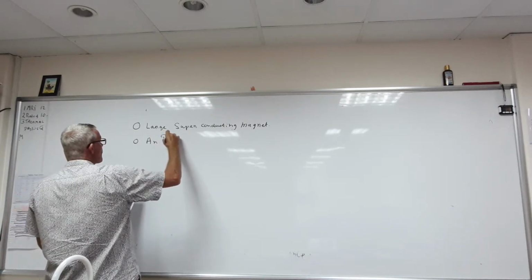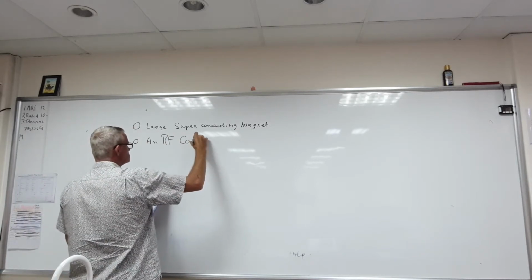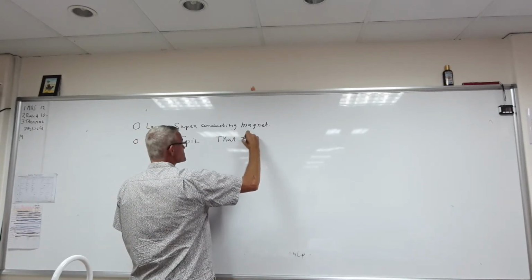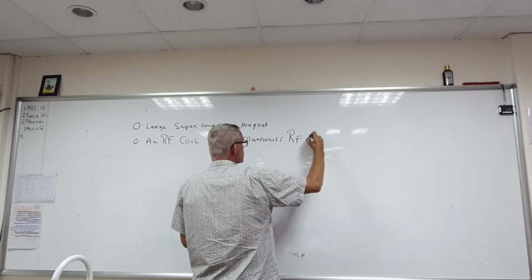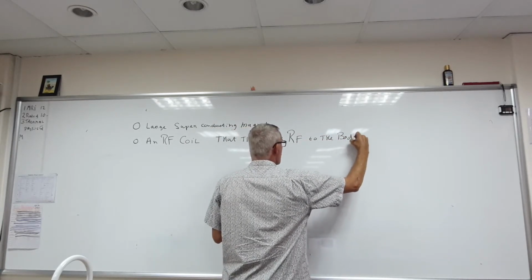Then we have a radio frequency coil, 64 megahertz, and this one transmits radio frequency to the body.